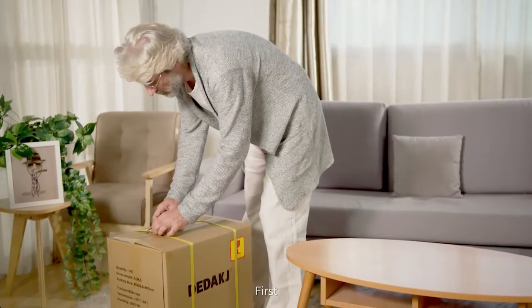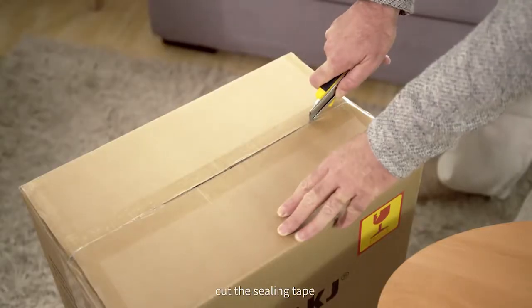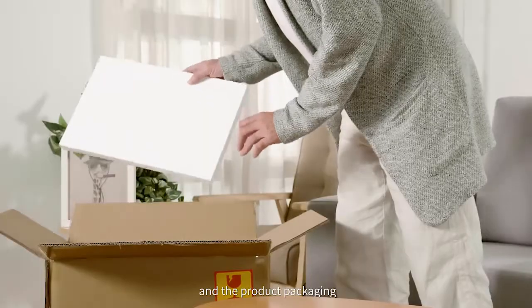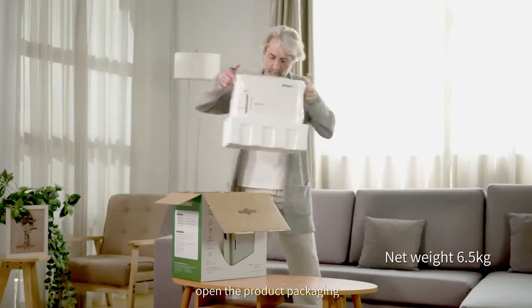Thank you. First, cut the strapping band. Then, cut the sealing tape and take out the shockproof foam board between the courier box and the product packaging. Take out the product and open the product packaging.